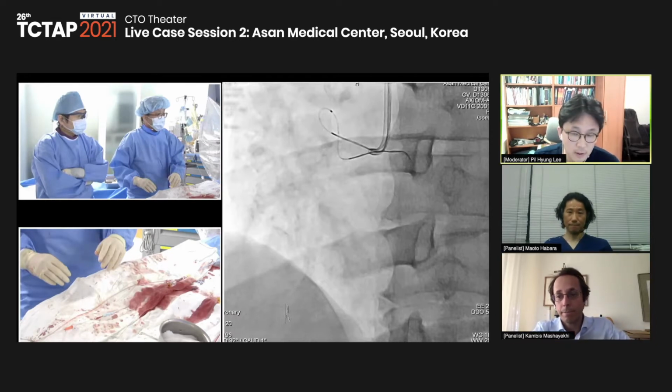Yeah, I absolutely agree with you regarding the antegrade puncture point. Personally, I really spend lots of time gathering information on where I have to puncture, regarding the IVUS or CT or previous angio. And procedurally, I spend quite some time to correctly puncture the point where I wanted to. Because we all know that if you get a right puncture, you can make a difficult case very easy sometimes. But if you don't, exactly, if you don't, you can make an easy case very difficult. So that was one concern of mine in this case.